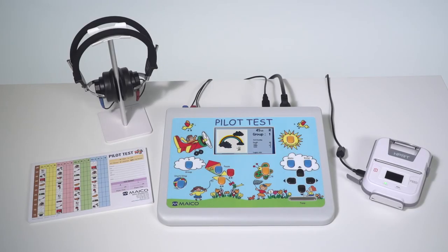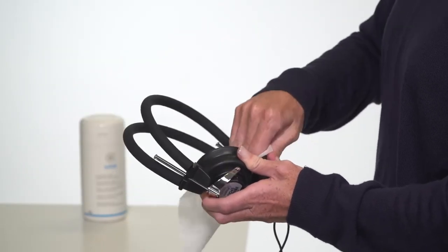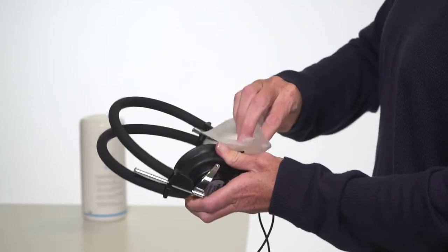Results can be captured on the included score pad or an optional 3-inch thermal printer. Upon completion of the test, wipe down the headphones and any portion that came into contact with the child with a disinfectant wipe.